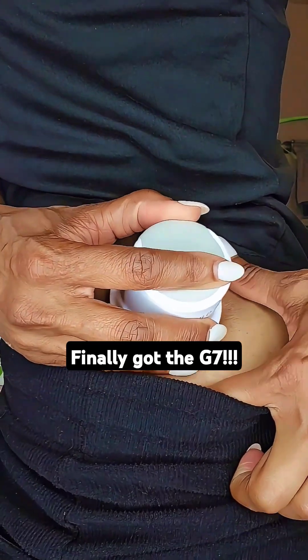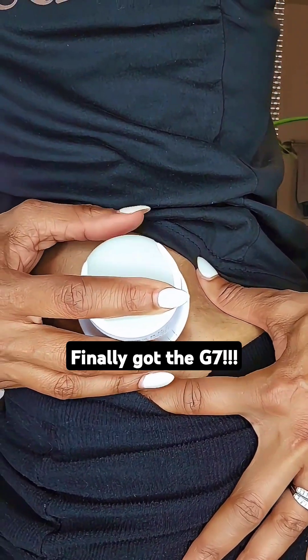Here we go. On the count of three — y'all count me down. Three, two, one.